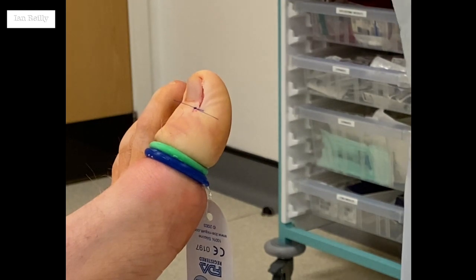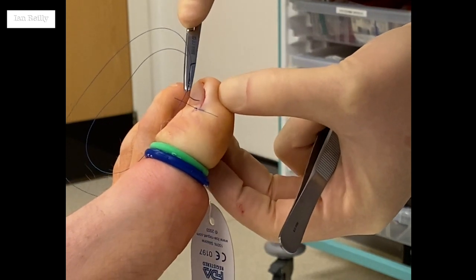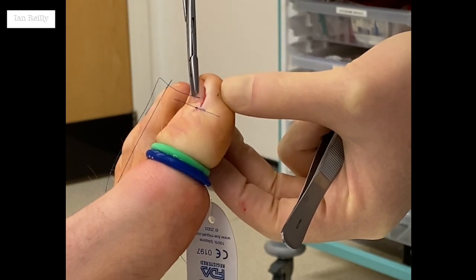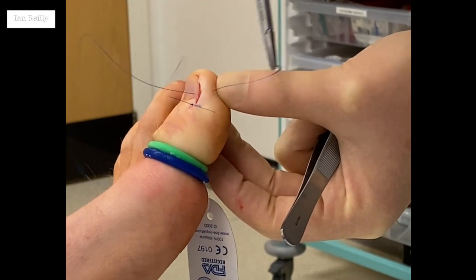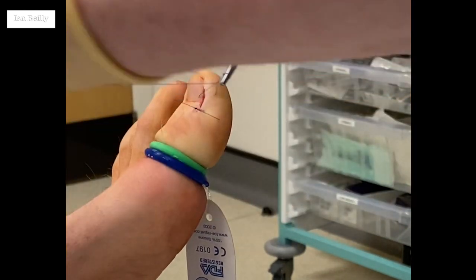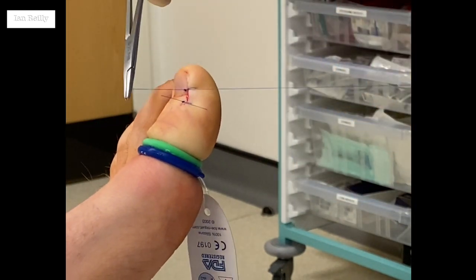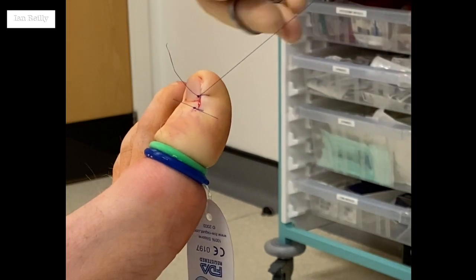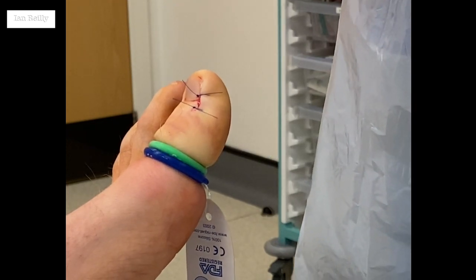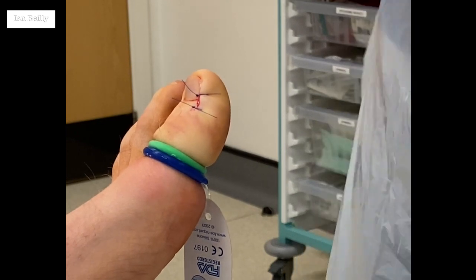Probably one more shall do it. So Andrew, typically leave these stitches in for two weeks — give it a chance to really kind of knit in. I'm as confident as I can be that we've got all the remaining root out of that. So a little bit sore when it wakes up — I want you to start on some painkillers as soon as you can, so that they're percolating in the system before my anaesthetic block wears off. Anywhere between 5 and 10 hours — 5 is about average — but it can be a bit sore when it wears off.